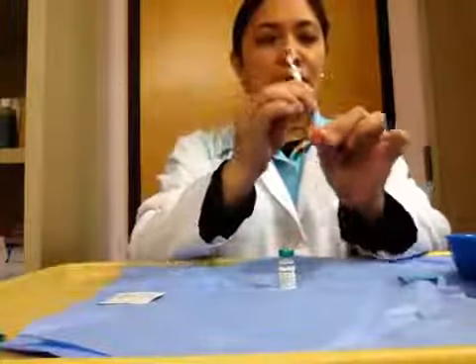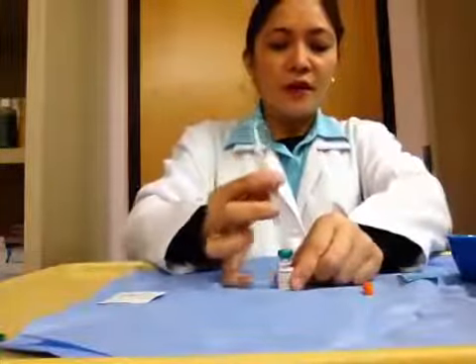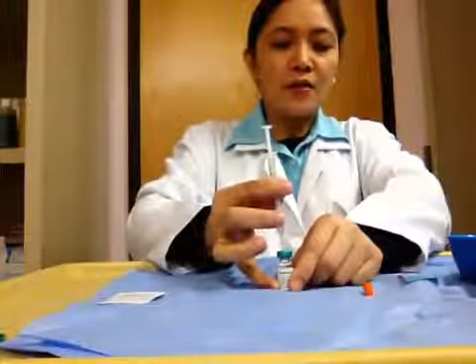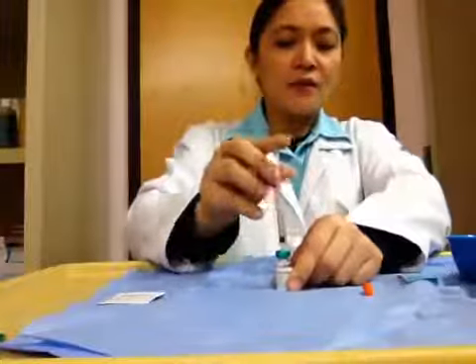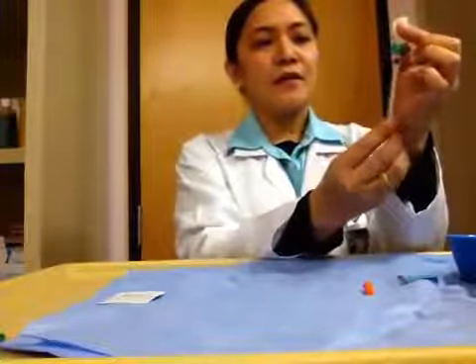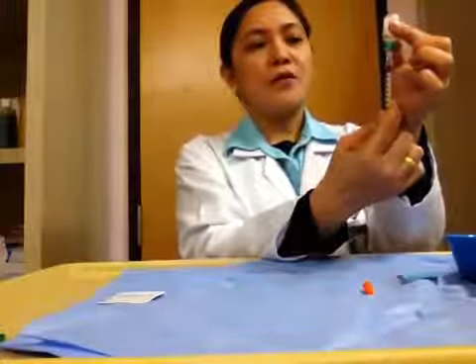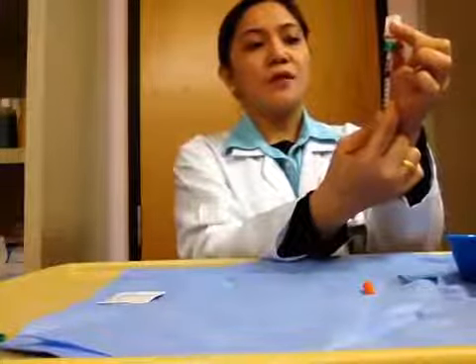Let's say 20 units of insulin. So you will place it at the 20 unit calibration with the air to be injected inside this vial. Then remove the cover of the needle and inject the 20 units of air into the vial. Invert the vial and get the desired amount of medication, which is 20 units.